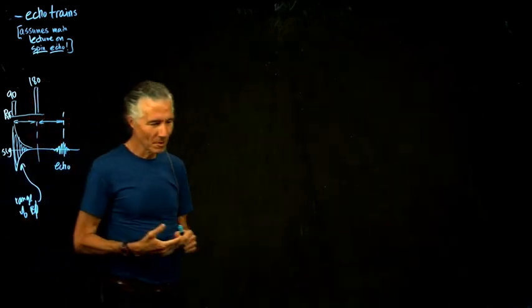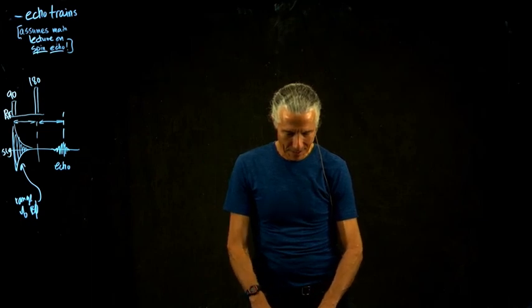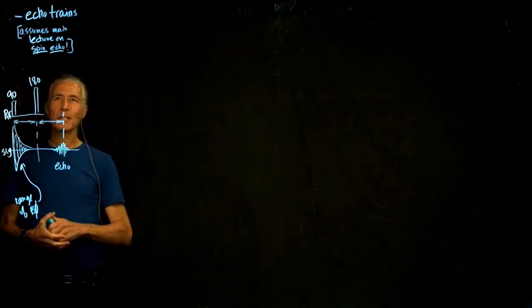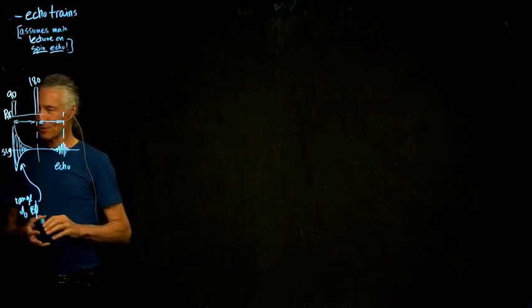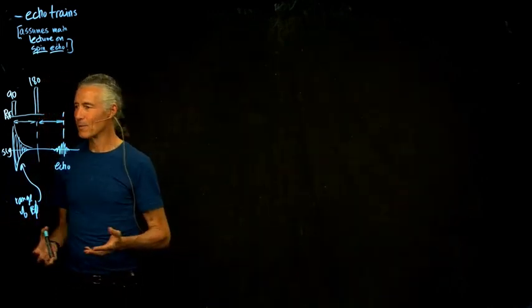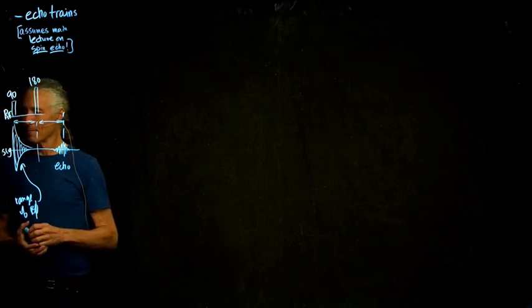If you do like 6 RF pulses, you get 121 echoes. So the bottom line is it's actually really easy to make echoes. In fact, the problem is too many echoes. Like I said, if you do 6 RF pulses, you get 121 echoes. But in a typical sequence, you might be doing something like 10,000 RF pulses. So you're going to get millions and millions of echoes.